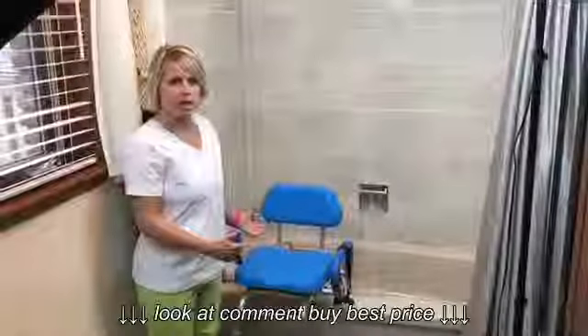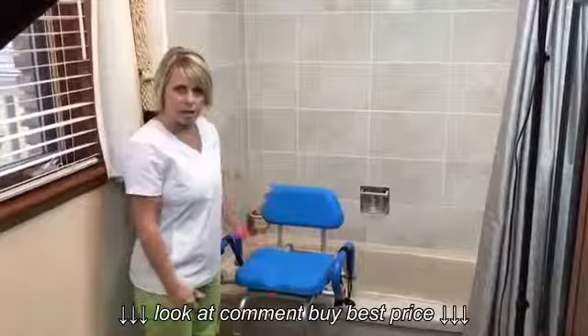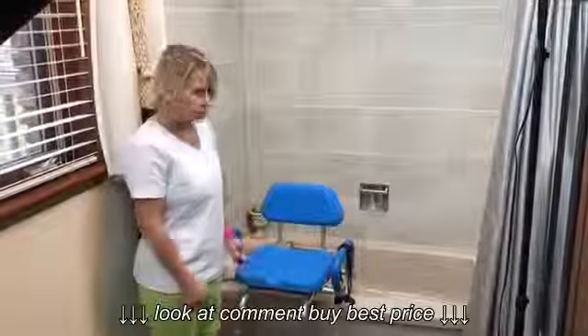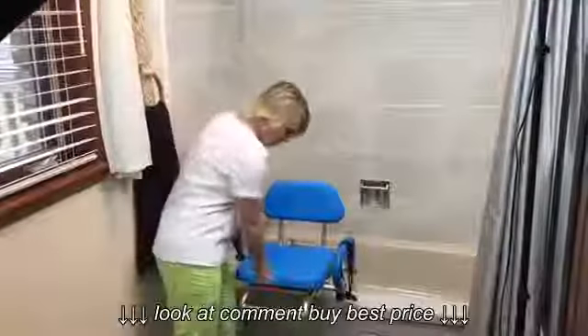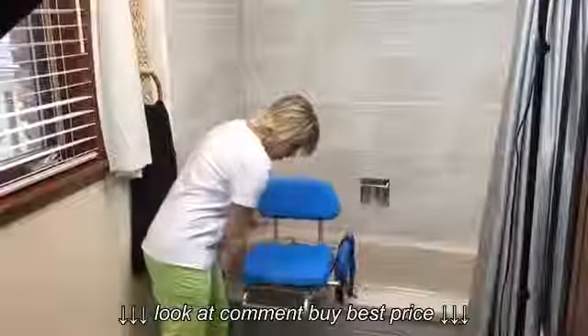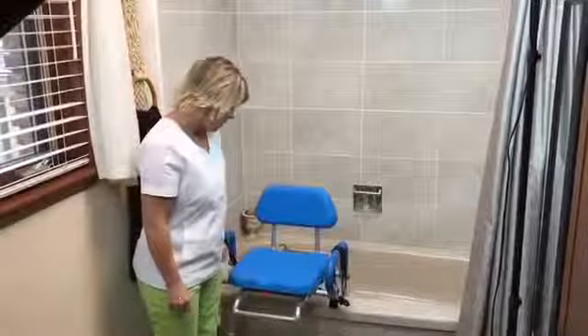Now I'm going to show you how to use a newer style bath transfer bench. I've already made sure it's at the proper height for myself, and the seat is facing out on this one. You can adjust it with this lever, but I'm going to have it start facing this way.